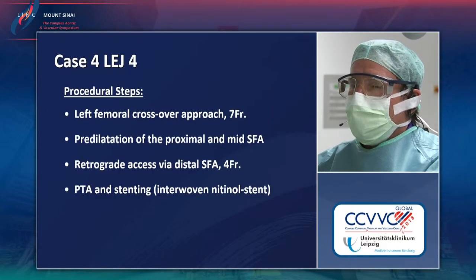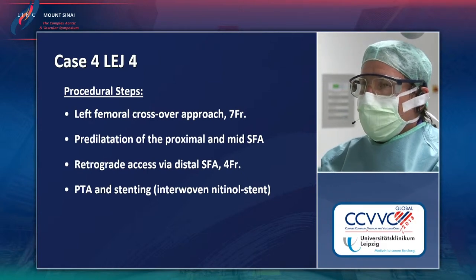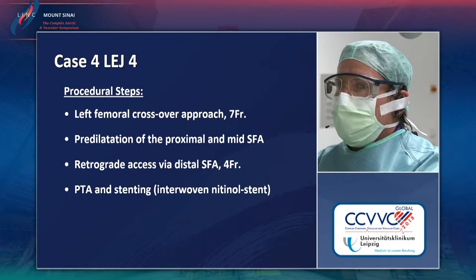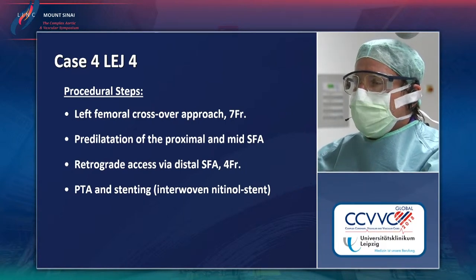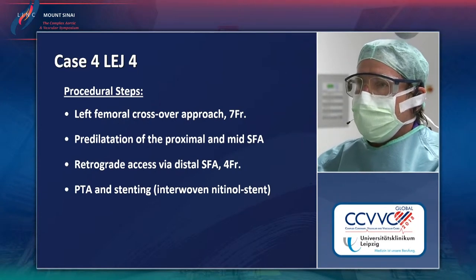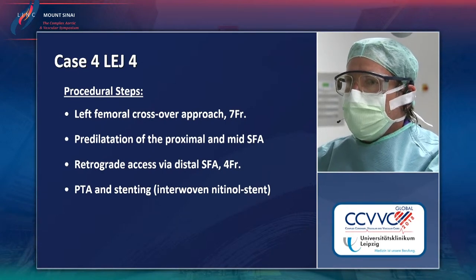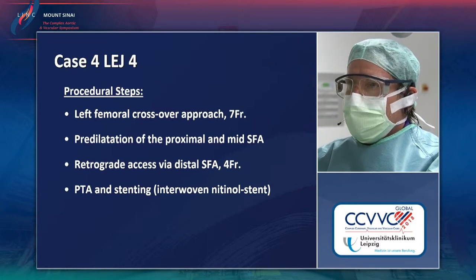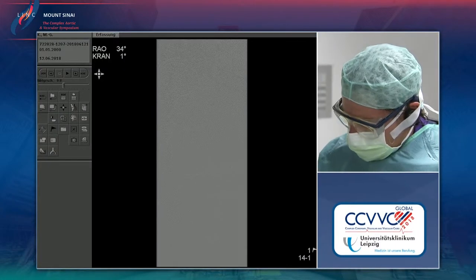This is our strategy. We come from the left side crossover approach, as usual for our SFA treatments. We want to cross the occlusion and if necessary also from a retrograde puncture, either via the distal SFA or, if necessary, we are also prepared to puncture the proximal anterior tibial artery. This will be followed by PTA and probably stenting — in this case with calcification, the Supera stent will probably be necessary.